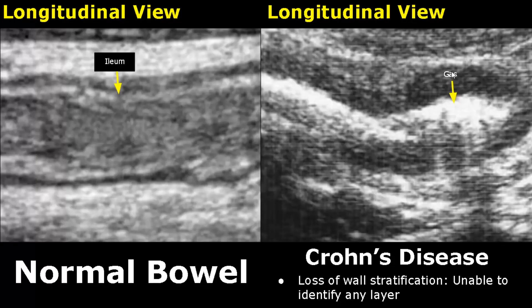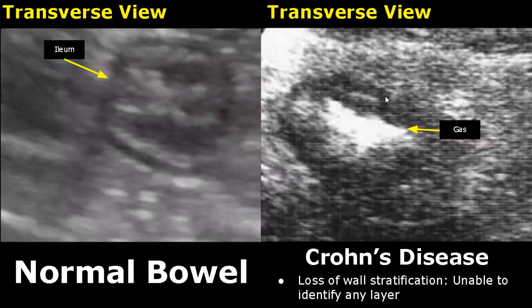Here is a transverse view showing loss of wall stratification. No layers are identified, and there is gas in the lumen of the ileum.